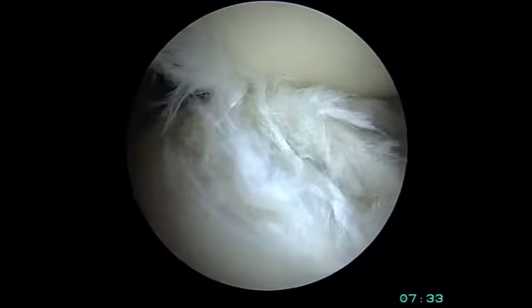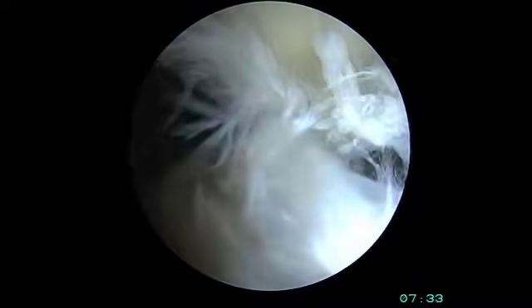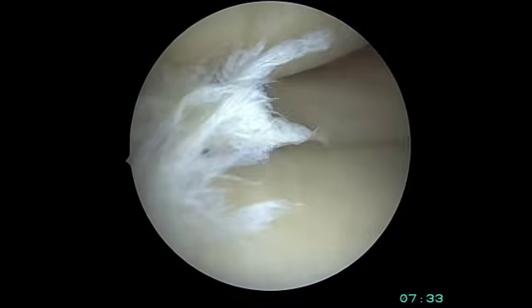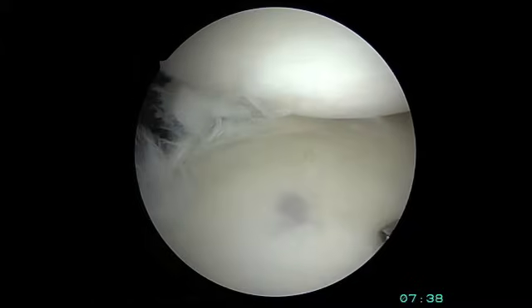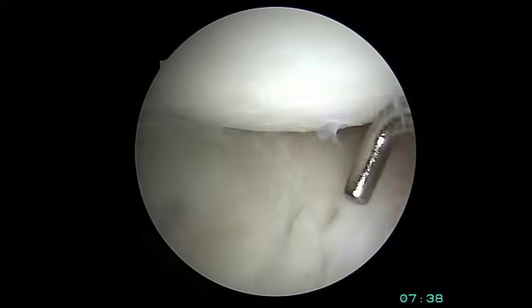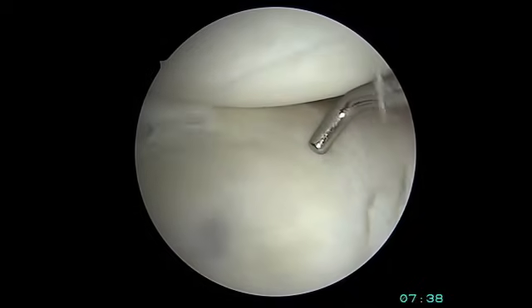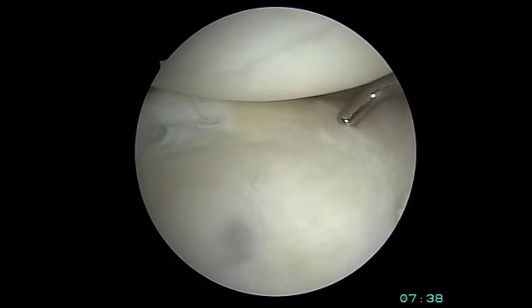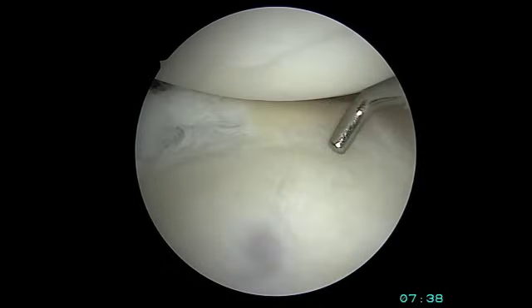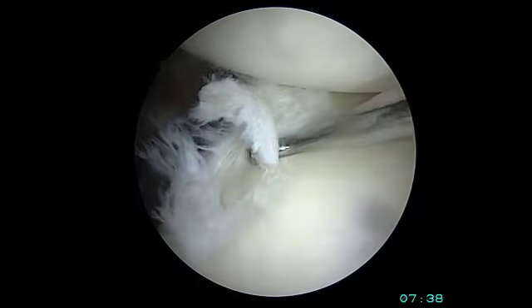When we view this tear from inside the shoulder joint, we first see a lot of fraying and abnormality in the posterior labrum. As we change our viewing portal, we can evaluate more of the shoulder — the humeral head and glenoid, or ball in socket. The probe is pointing to the normal anterior labrum on the right side of the screen, while the posterior labrum on the left shows clear fraying and tearing.